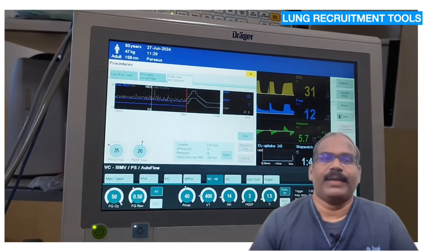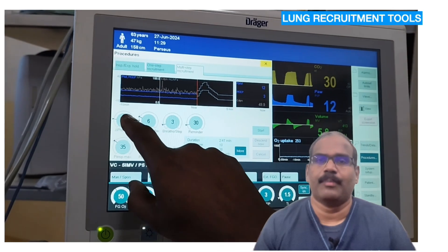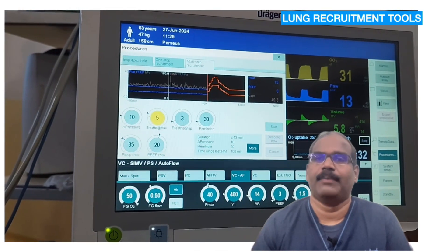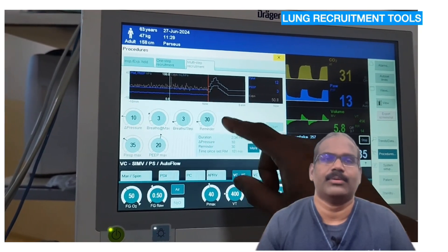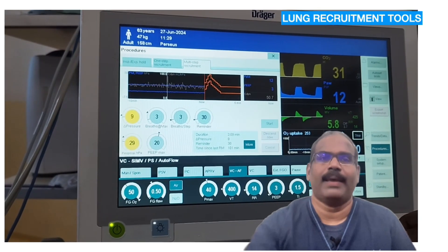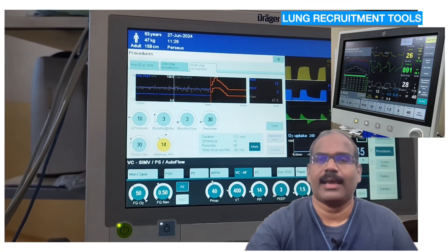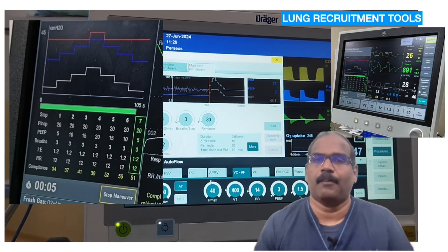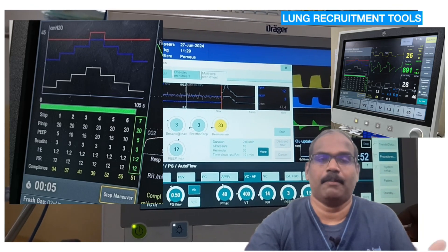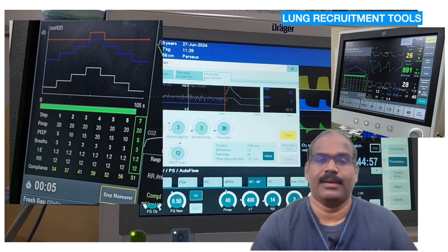Along with newer modes of ventilation, present anesthesia ventilators also provide lung recruitment maneuvers in single-step or multi-step fashion, as per user-defined pressures, without having to disconnect the circuit or switch to manual mode. The recruitment maneuvers and the compliance trend help anesthesia providers decide who benefits and how much PEEP is to be applied during ventilation. You can see the increase in compliance on the chart shown on the left-hand side of the screen.